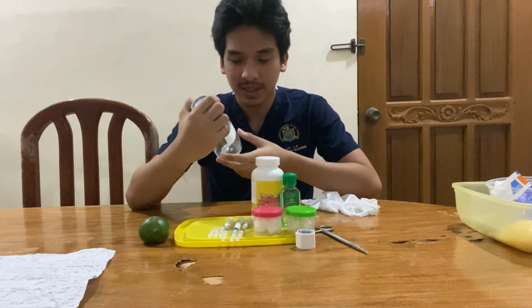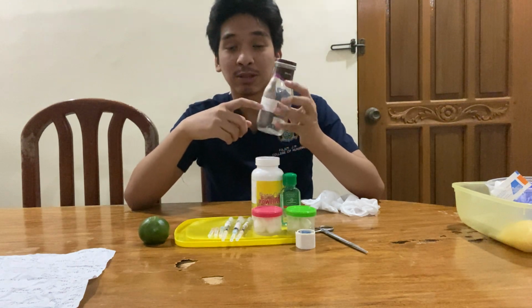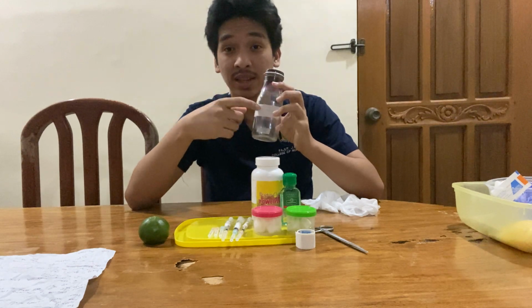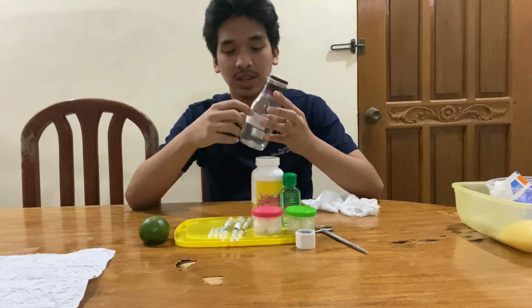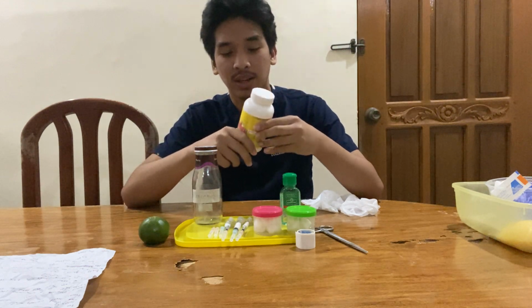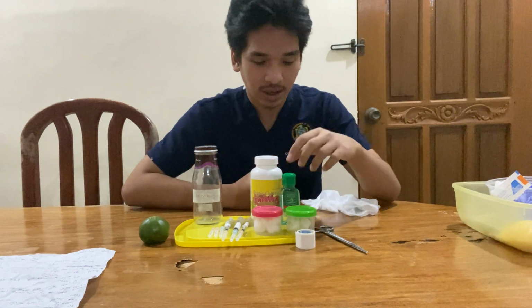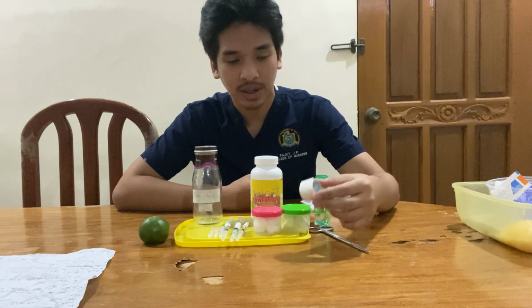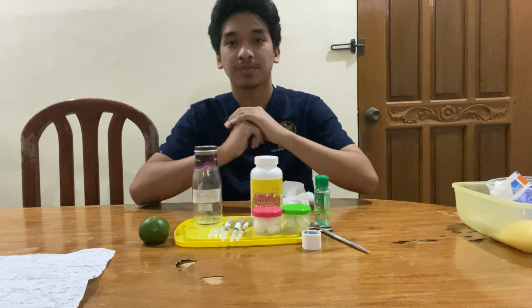And then we have our medicine. Assuming that this is a vial containing medicine, this will contain the cefuroxime, which is the antibiotic, the tetanus toxoid, and the insulin. And I also have the sterile water that will be mixed with the antibiotic. Okay, and I also have cotton swabs, medical tape, and a clean pair of gloves.